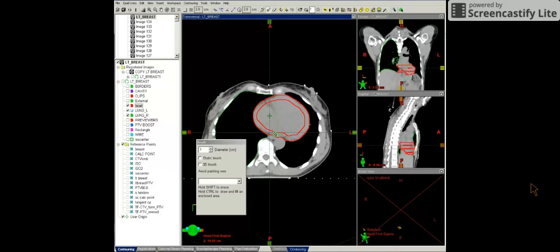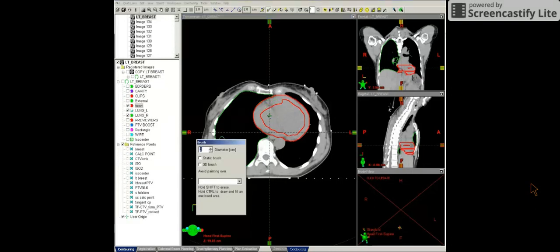And I want to make sure I avoid the esophagus directly below here. And now I can fill this in and use a larger diameter.